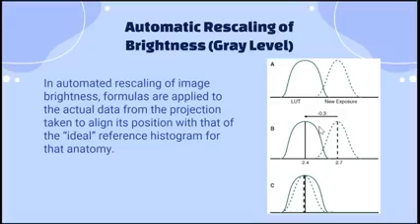The exposure, okay, or the brightness, sorry, brightness. Auto rescaling will fail if exposure field edges are not correctly detected by partition pattern recognition software, or if unexpected material such as metal within the field of exposure skews the data from the exposure field recognition.